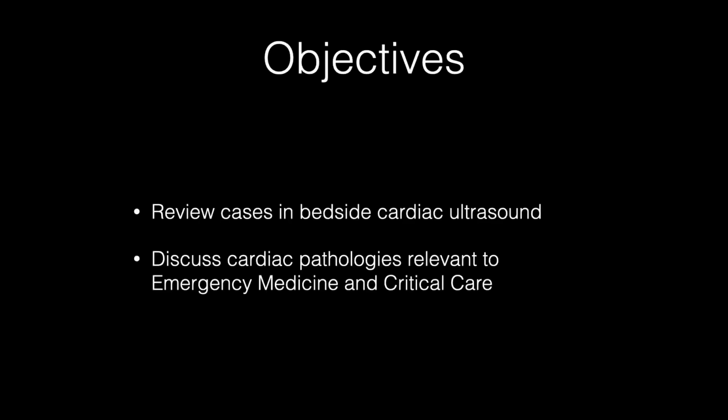With all presentations that involve CME, for the people watching this live, there are no disclosures to make here. Our objective today is to review some cases in bedside cardiac ultrasound and discuss cardiac pathologies relevant to emergency medicine and critical care. That's really who joins a lot of these conversations and talks, so that's who we're going to gear this to today.